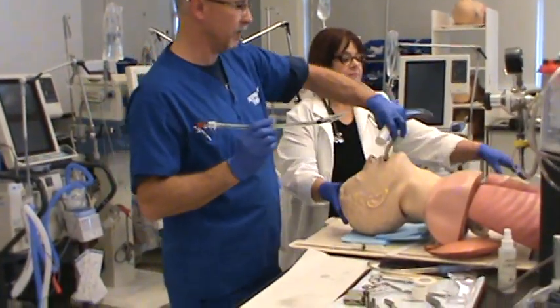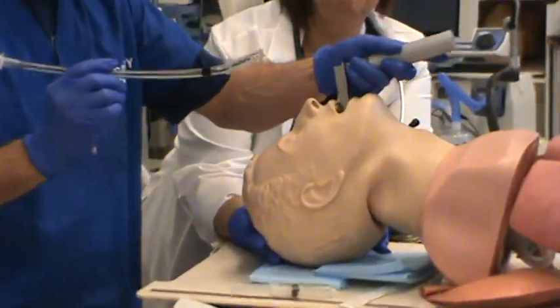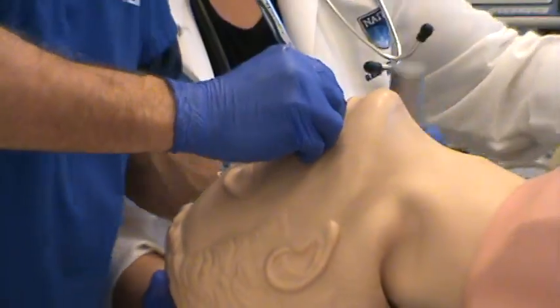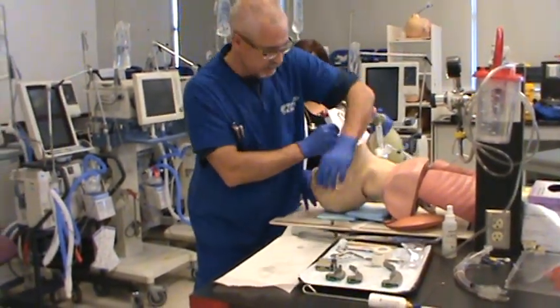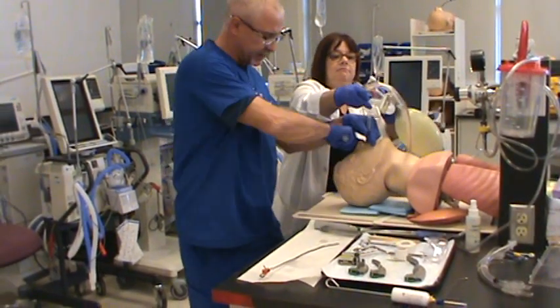We'll remove the OPA. Going in on the right-hand side, looking at the structures of the airway — there's my open glottis — in and up to the teeth. Look at my mark: I'm at 21 at the patient's teeth. I've closed the laryngoscope blade, taken the stylet out, holding the tube in place, and Diane's going to connect.